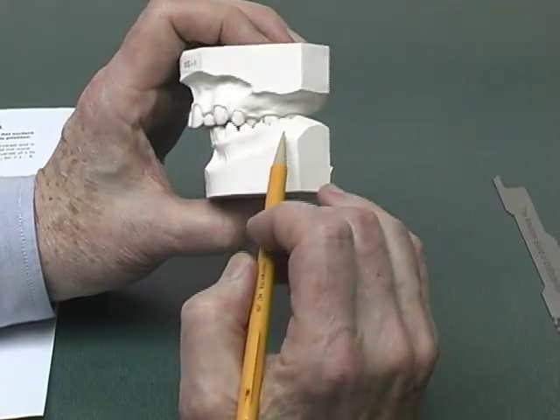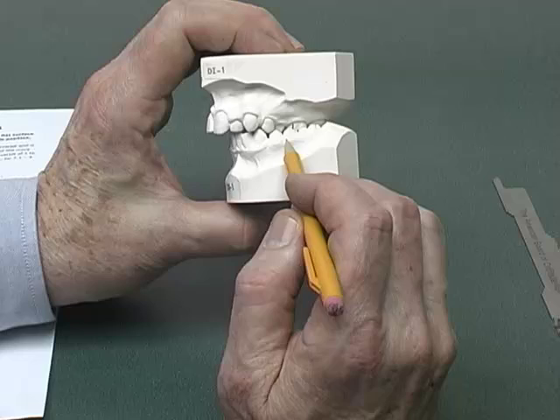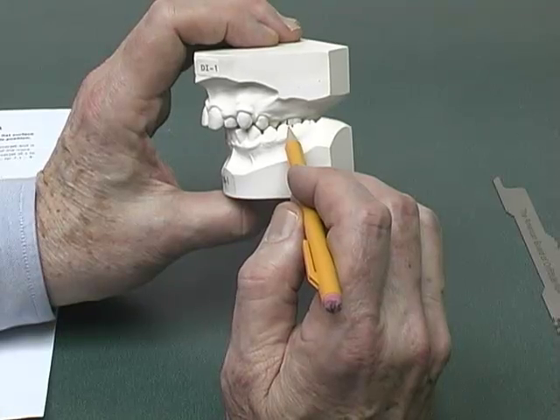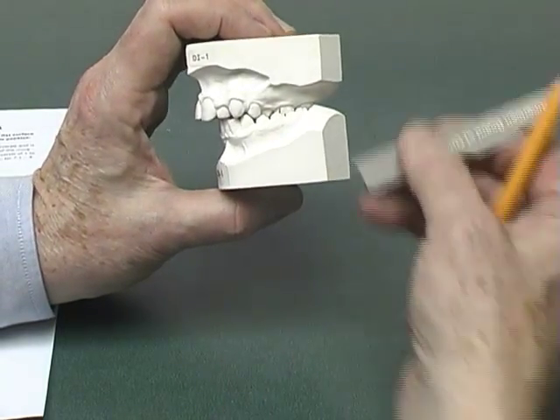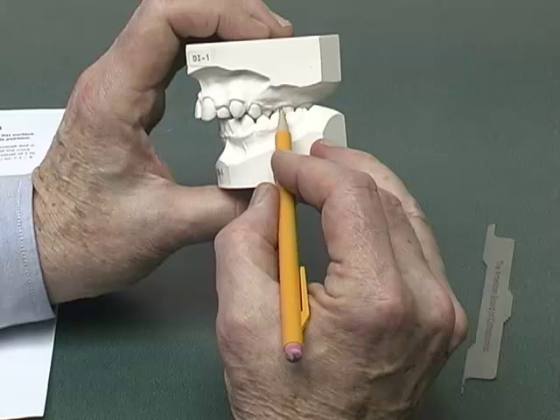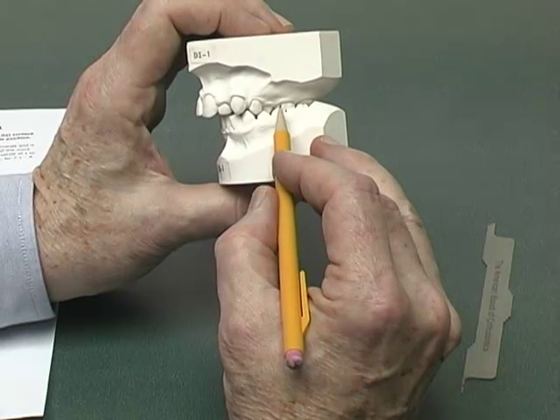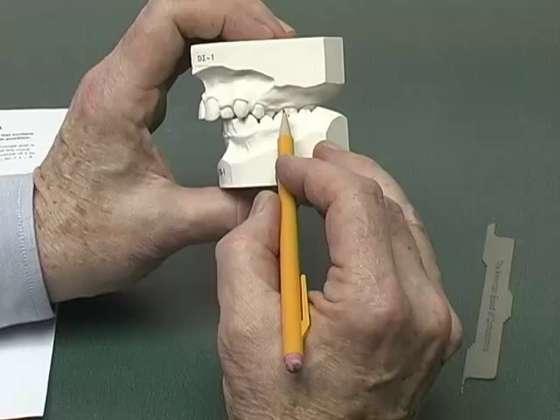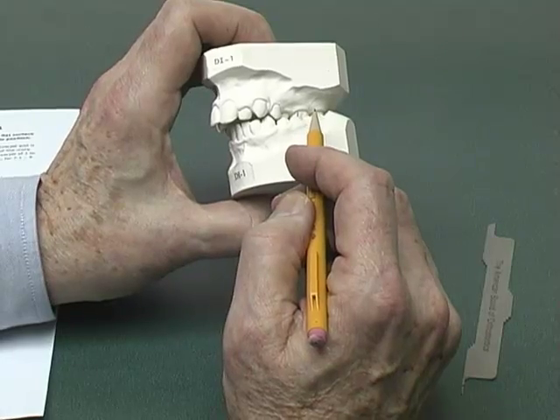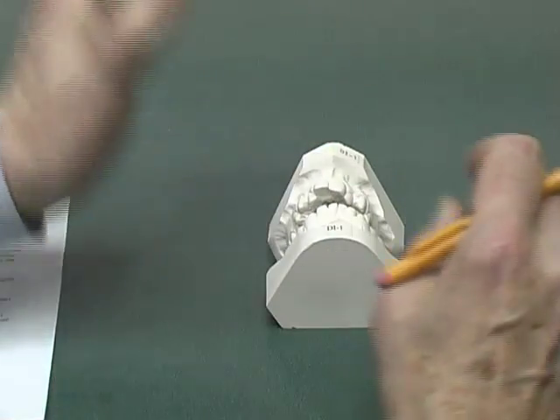Now looking at the left side, which is also in crossbite. Note that the vertical line is forward of the interproximal area, and the millimeter reading is two millimeters past the full step. So this score will be the full points for the full step class 2 — four points — plus one point per millimeter past that — two additional points — for a total of six points for the left side. So four points on the right, six points on the left: the score would be ten points for the occlusion on this particular set of casts.